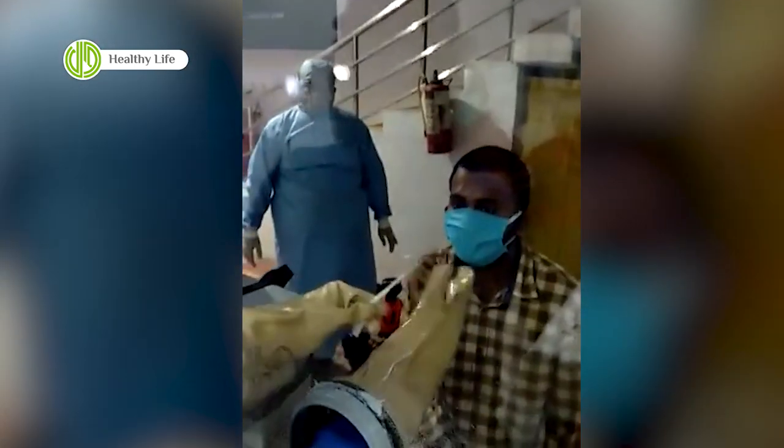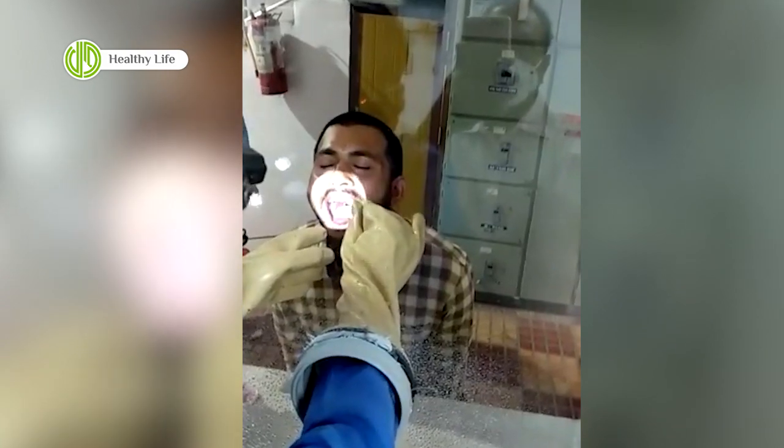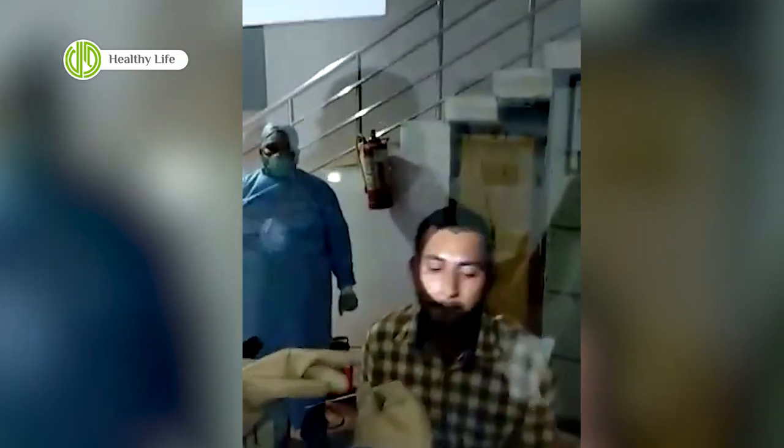The doctor is inserting his hands again through the glass plate. He has taken the swab, removing it and taking it out — that is the swab with which the sample is taken from the throat. This is the time when the patient is prone to cough, and that is when the glass pane helps in protecting the doctor.